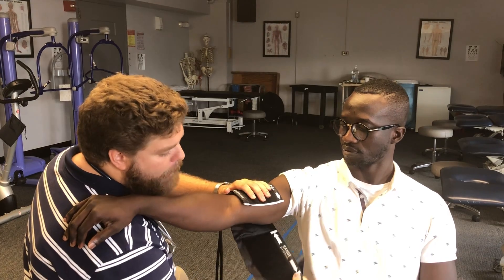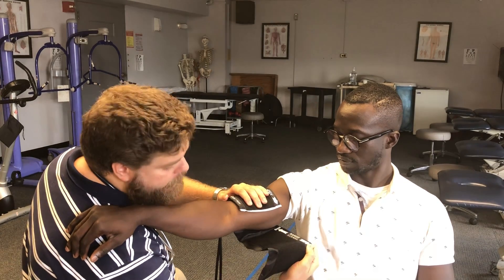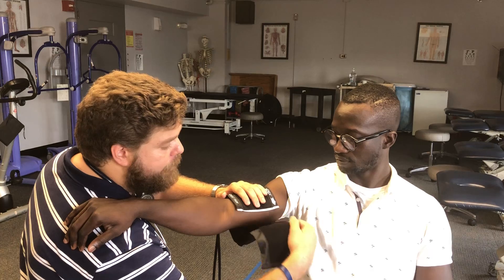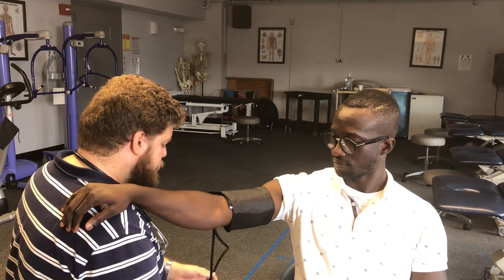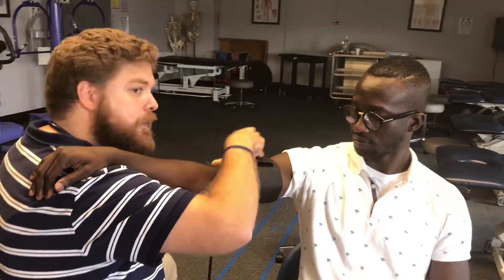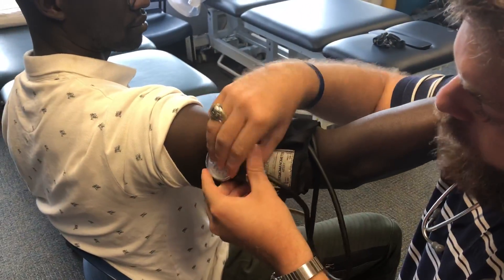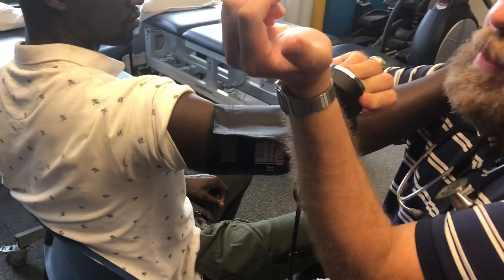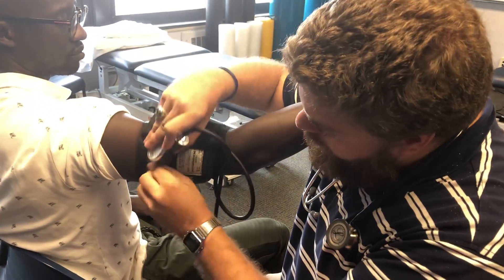We'll wrap it around. There's a little guideline on most cuffs — you can see this little range indicator. This will show us if the cuff circumference is adequate. If it goes beyond the range, the arm's a little too big; if it's below it, the arm's a little too small. Now you have this little dial here — you can place it either on the little clip here. Some students actually taught me how you can clip it to your wristwatch — a nifty little technique, especially when doing exercise blood pressures. But for the purpose of this, we'll clip it on here on Yomi and get going.